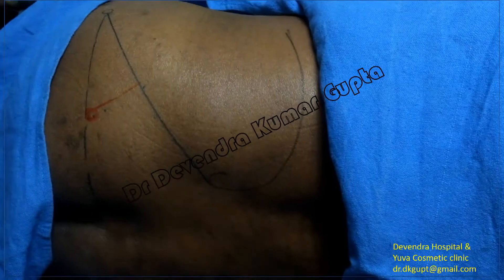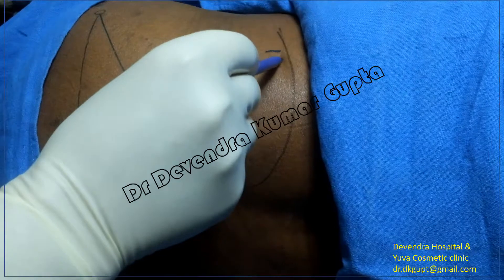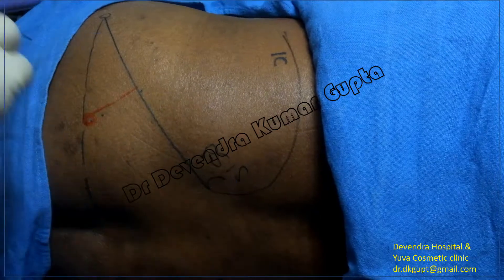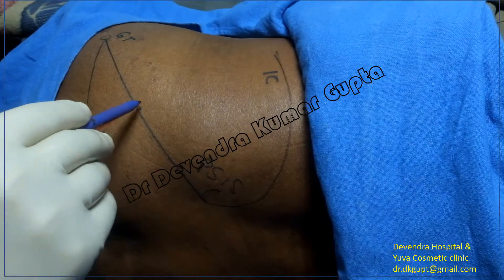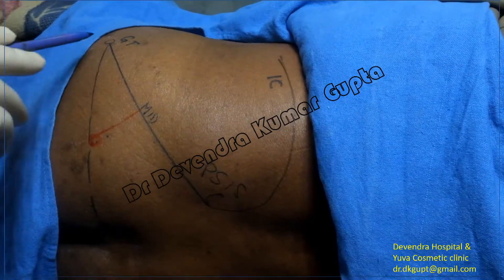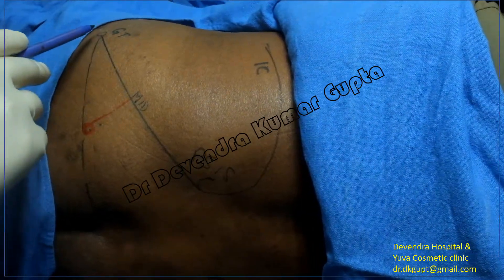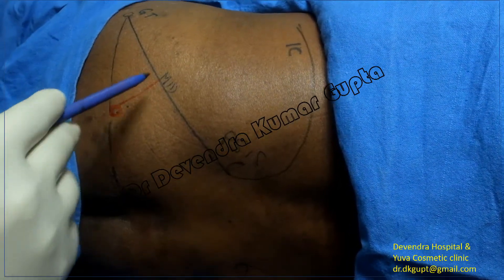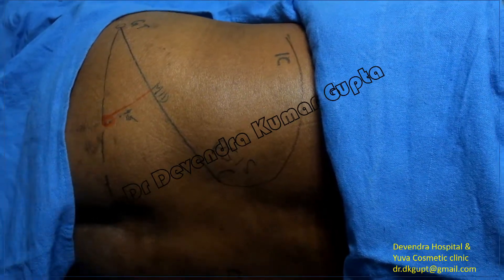I am now giving the sciatic nerve block from the posterior approach. I have marked the iliac crest, the posterior superior iliac spine, and the top of the greater trochanter. I joined these two lines and took the midpoint, then drew another line from the greater trochanter to the sacral hiatus and took a perpendicular from the midpoint — this perpendicular point is approximately 4 to 4.5 centimeters, and this is the entry point for the sciatic nerve block.